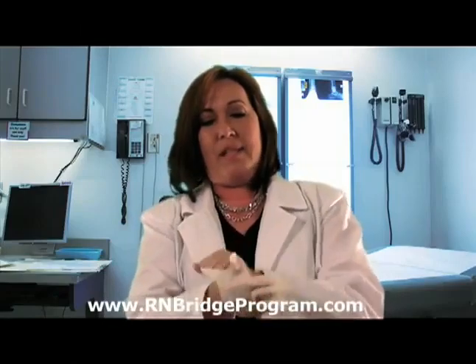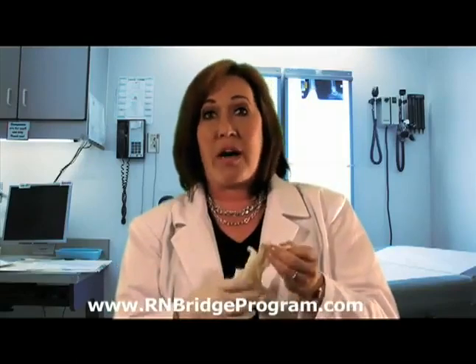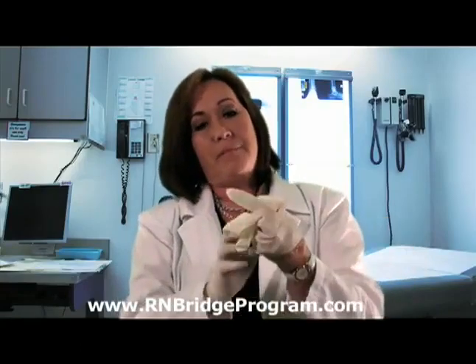And again, when we're talking about asepsis, we're talking about covering our hands with gloves. We're talking about not having artificial nails such as what I have on. I'm the instructor today with no real patient. If you had a real patient, nails are a no-no. Even real nails need to be trimmed into your fingertips. Your hands need to be washed prior to your procedure. And then we're going to put these clean gloves on.